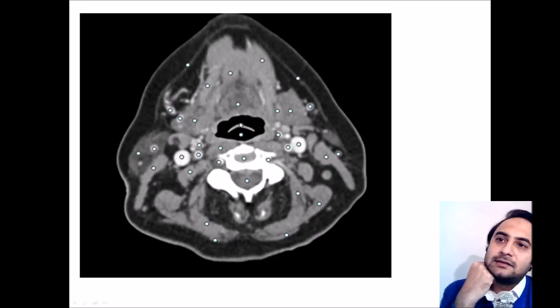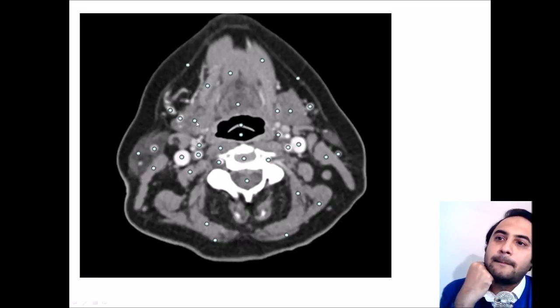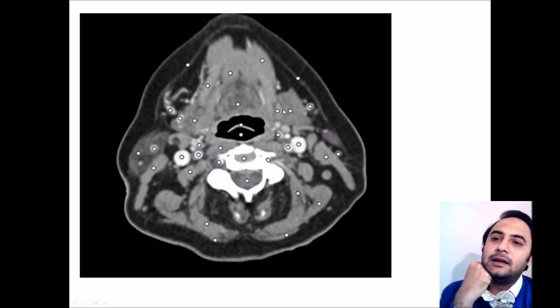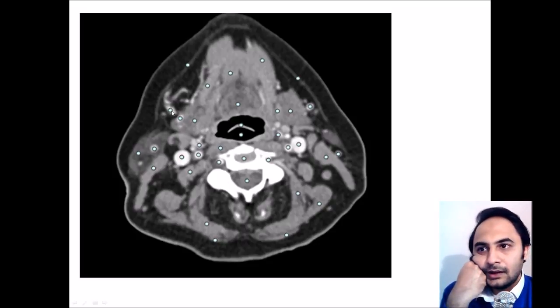On the next slide you again see the geniohyoid muscle and the mylohyoid. This small separate structure is the posterior belly of the digastric, and lateral to it is the submandibular gland — bilateral submandibular glands you can appreciate here. These hyperdense areas crossing it are the facial veins.